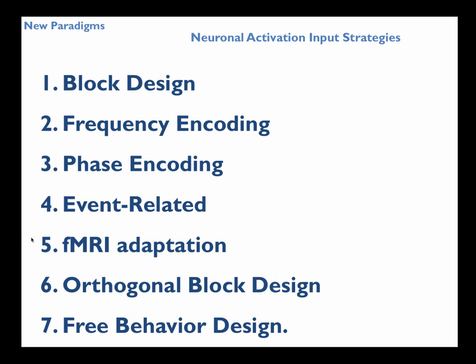It's all up for grabs right now. Okay, so now there was also a massive explosion of types of paradigms. We started with block design, kind of taking from the PET literature, 20 seconds off, 20 seconds on. Very easy to process. It's actually nice to use paradigms like this because you're constantly fighting against signal drift. If you have a block design like this, and the signal is drifting, then you can actually pull this high frequency out from the signal drift. If you have a very low frequency, like 10 minutes off and 10 minutes on, you would be contaminated by the drift effect. And so that's why we go on, off, on, off.